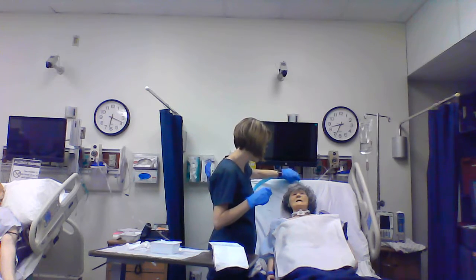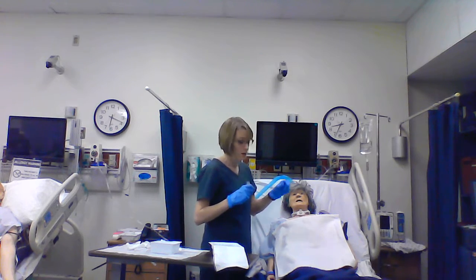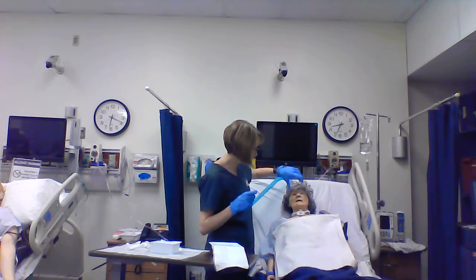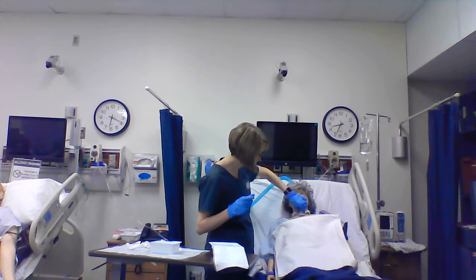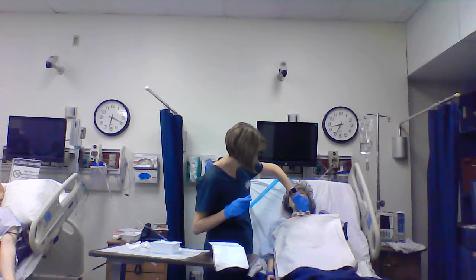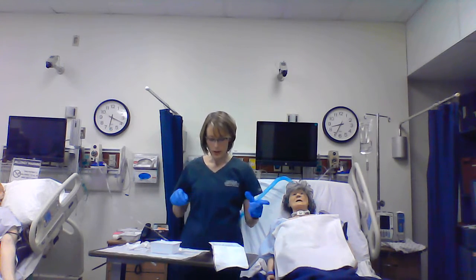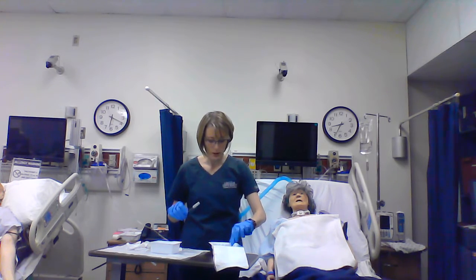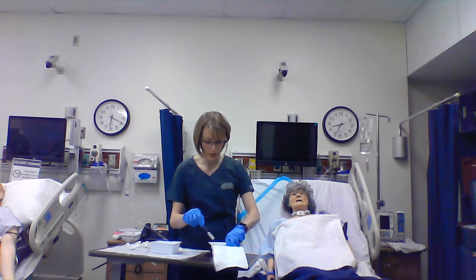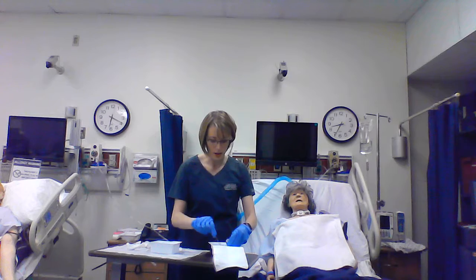Let her know again, if she's not familiar with the procedure, what you're going to be doing so she knows what to expect. I'm going to contaminate one hand, which I already did when I took her oxygen off, and remove her cannula, this inner cannula. And you can drop that in your hydrogen peroxide and saline mixture. And you want to clean this inner cannula, being really, really careful that as you do this, you do not fling secretions and dirty material all over your sterile field.